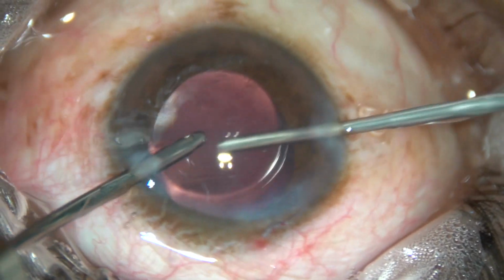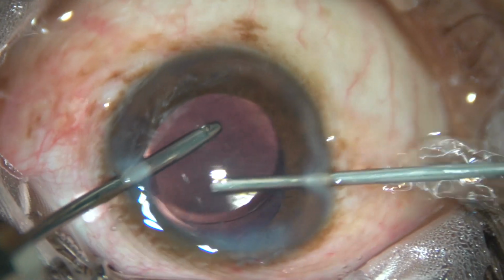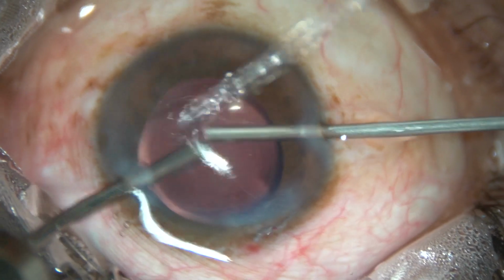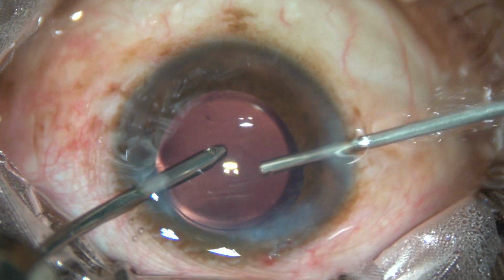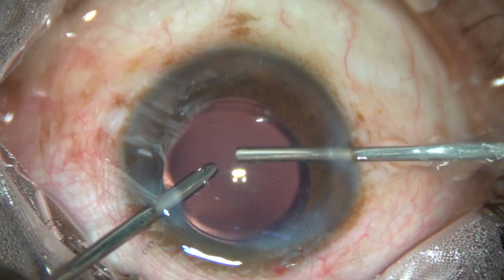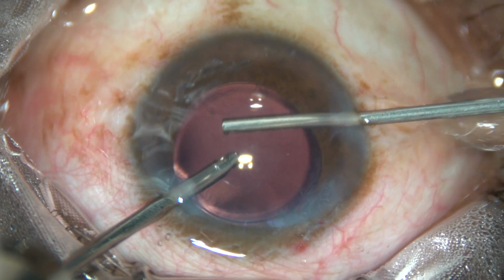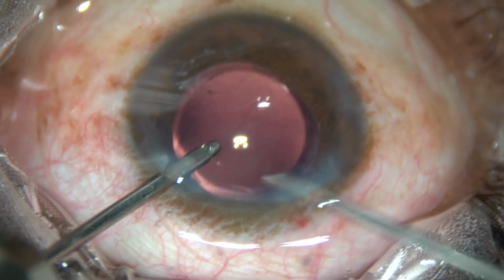Yes, the haptics have gone into the capsular bag. Yes. Since this is a hydrophilic acrylic intraocular lens, it should be placed in the capsular bag. This is the first choice.